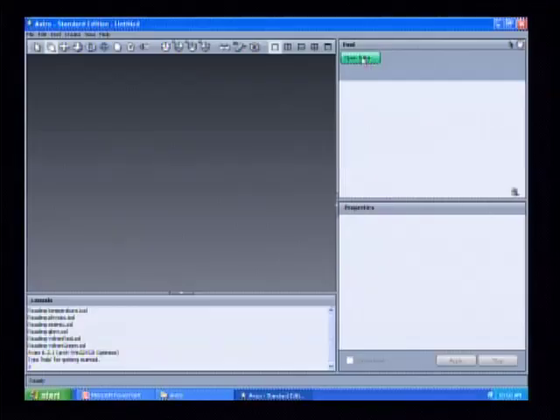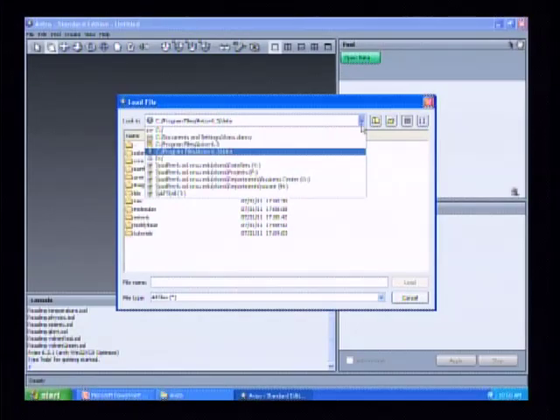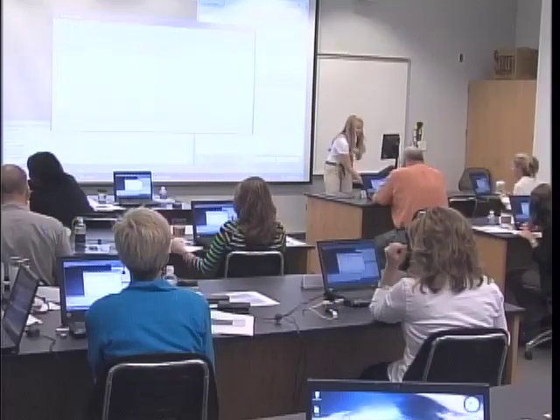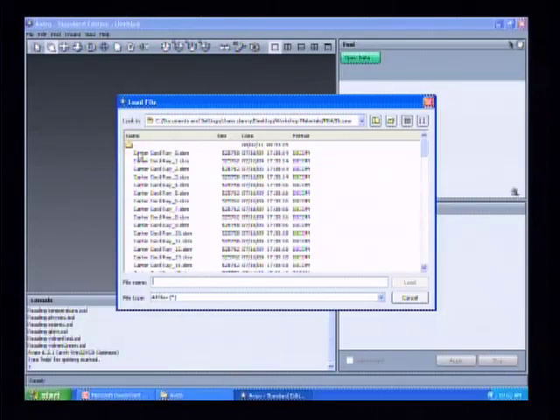What we want to start out with is to go up to the green button in the pool and press Open Data. I believe Imam has loaded this data set somewhere on your desktop. Is that correct? If you can change your drop-down menu to find the desktop on your computers, you should be able to get to this M64 folder. If you open this M64 folder, you'll find a folder called DICOMs. You can open that folder, and these are our DICOMs.